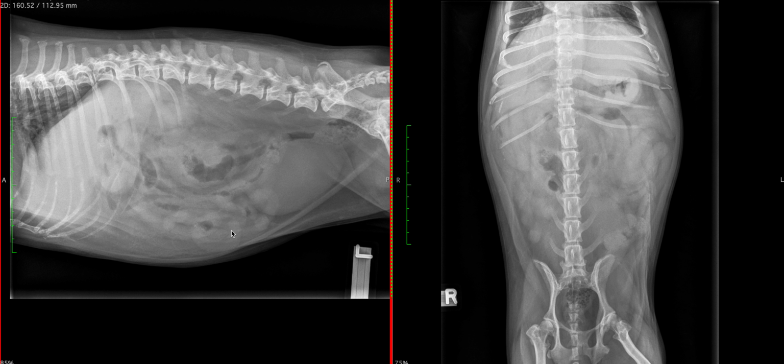It should be noted that in critical patients that are dehydrated, as you improve the hydration status, the volume of effusion can increase proportionally. A large volume of abdominal effusion markedly reduces the serosal contrast in the abdomen by being superimposed and interspersed with peritoneal fat.